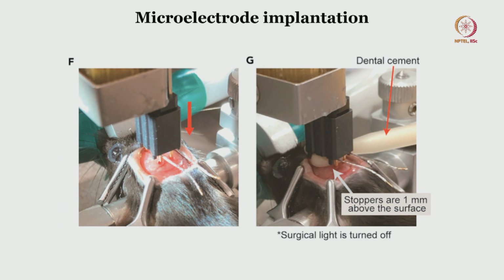So, once that is done, there is a difference of depth that is going to happen, which you need to account for during the depth calculation. Around 0.2 to 0.3 millimeter, or for example even 0.5 mm of displacement can happen once the CSF comes out, alright. But by and large you will be able to implant the electrode either onto the surface or a little bit deeper than the surface of the brain, and you will be able to record decently good electrocorticographic signals, alright.